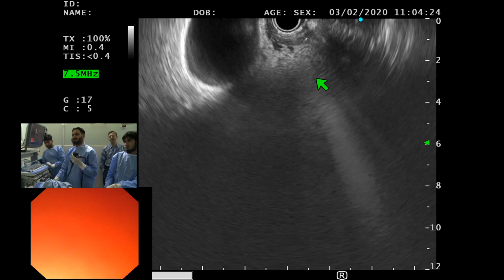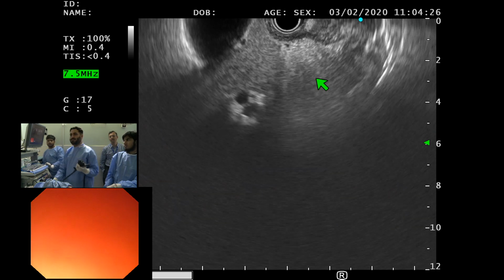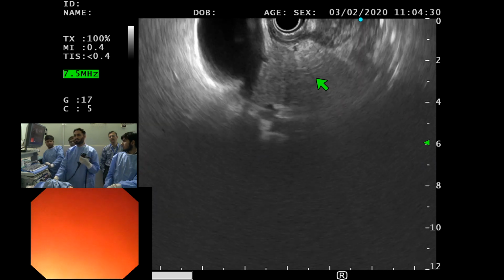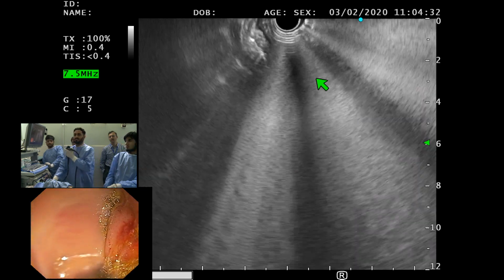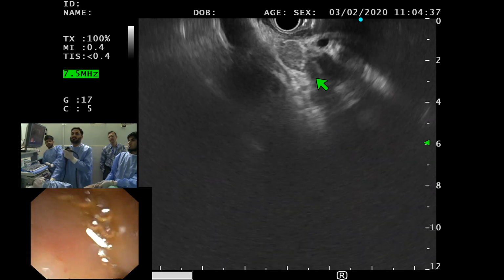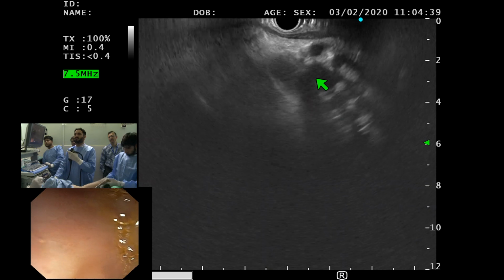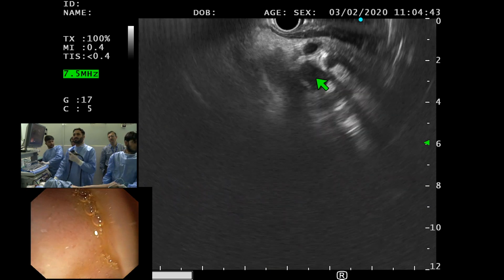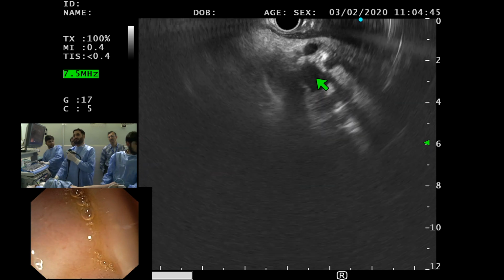Yes, this gallbladder. So when you see the gallbladder, that means you are too superficial. You need to go a little deeper in there. You are sitting at the pylorus, right there. Good. Up there, no, not too much. Take a look at the EUS image, right? You see the bile duct right on the top, correct? So pay attention to that.